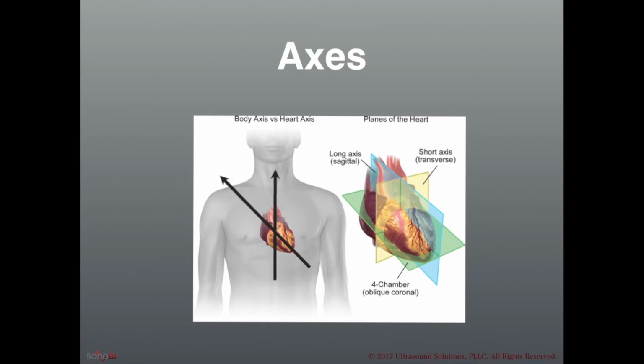Here's a view of the axes of the heart that we're going to obtain. Recall that anytime we're examining a solid organ, we want to view it in both a longitudinal and a short axis. And the heart is no different. We're going to examine it in a long axis and a short axis in multiple planes.